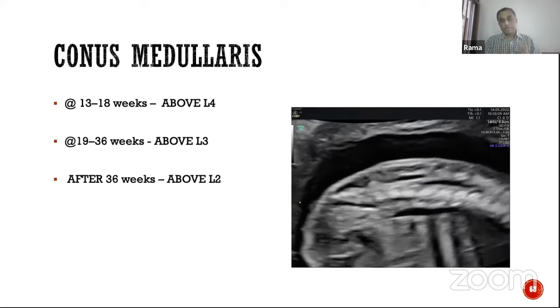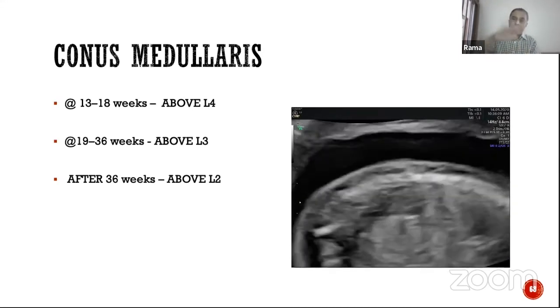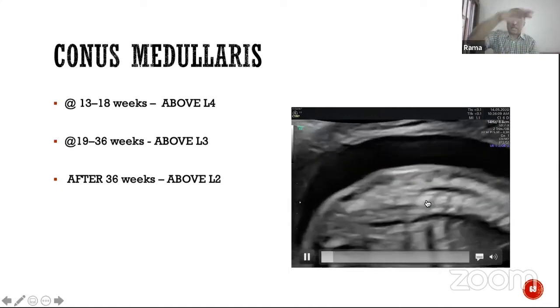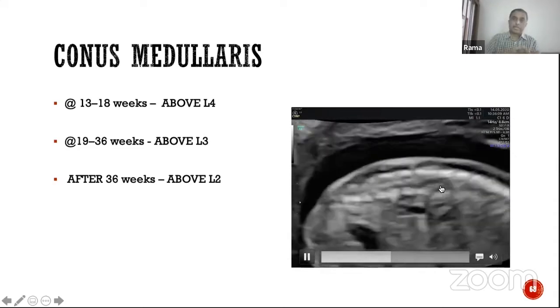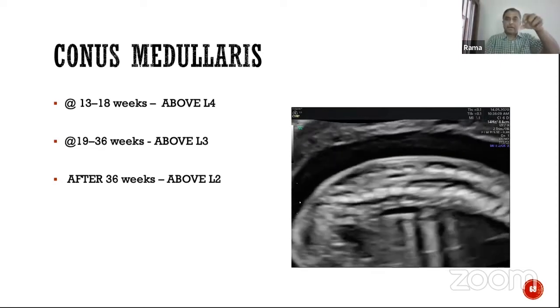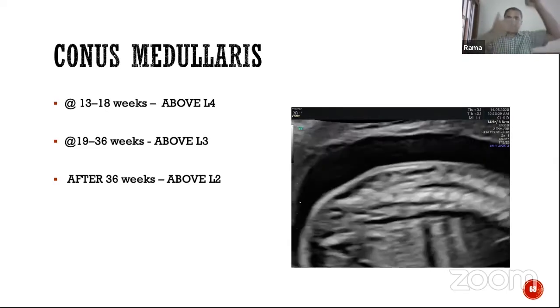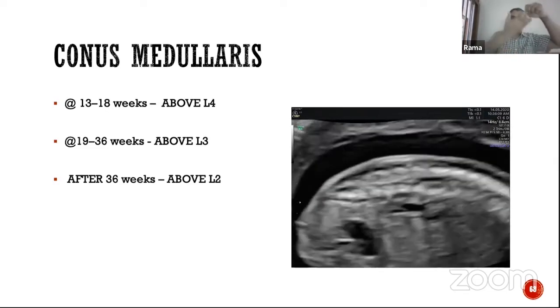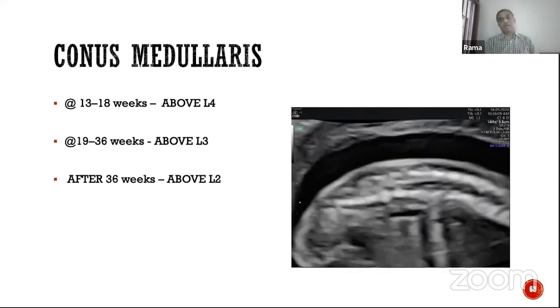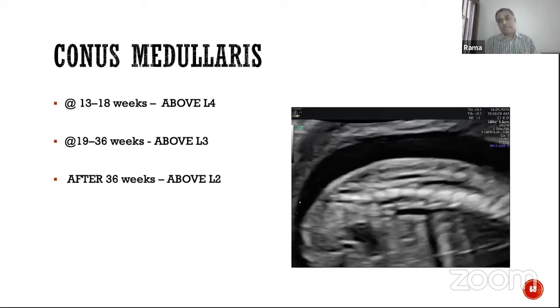That's number one. Number two, the spinal cord is hugging the anterior, that is the ventral aspect of the canal. It's never seen on the dorsal aspect. So make sure that you see this spinal cord going all the way on the ventral aspect. If there's a spina bifida, and the roots are going out, the spinal cord gets hitched up and leaves the ventral aspect, goes to the dorsal aspect. Right? So therefore, conus medullaris can be very well demonstrated. Higher frequency, position, magnification, extremely important.